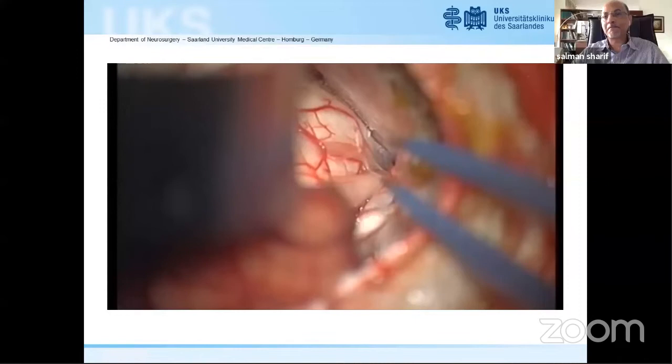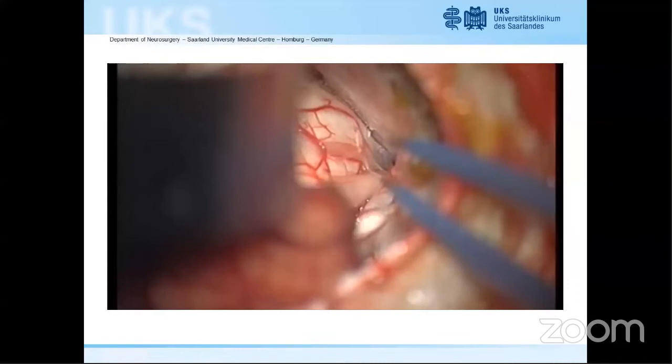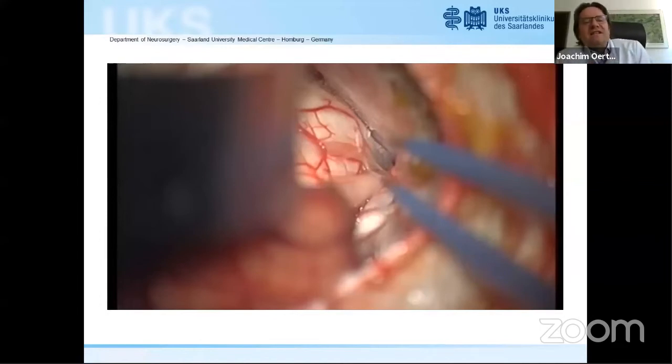It just came to my mind whether we can use intraoperative ultrasound to locate the entry zone in such a case if we don't have a navigator, for example. The problem with the ultrasound is that the ones we have, which really give good quality results, are too big.